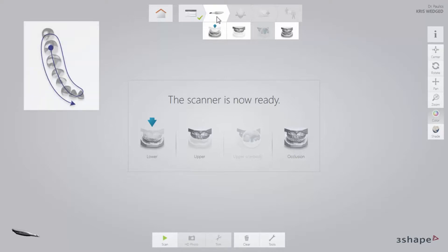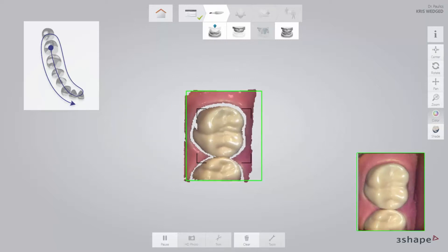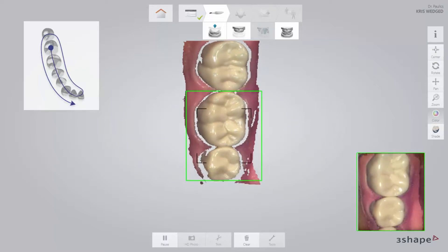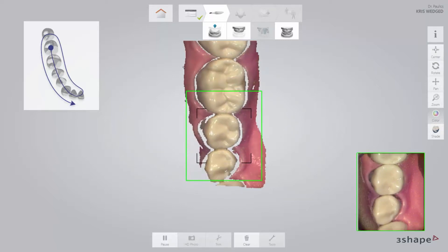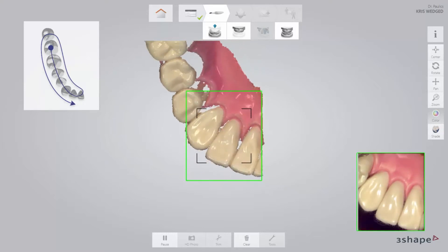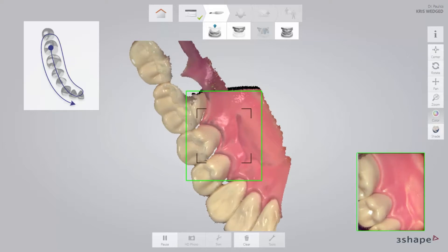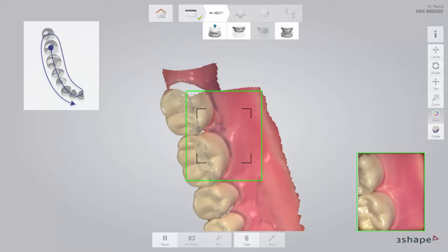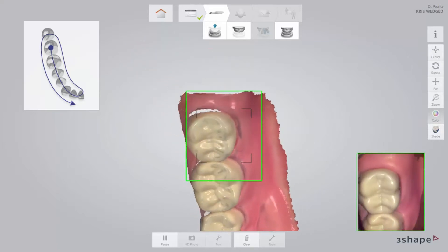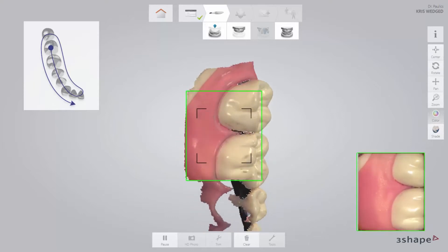Scan the opposing arch first. Follow the official scan strategy: start by scanning the occlusal surface from the molar to the canine. Then, as it is the lower arch, slowly roll to the lingual side and move the scanner in the distal direction. Finally, slowly roll over the last molar and scan the buccal side.